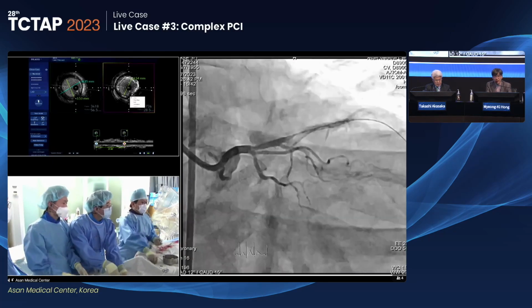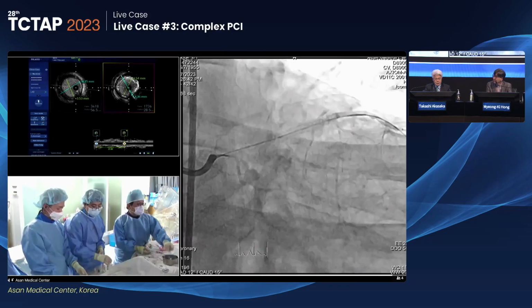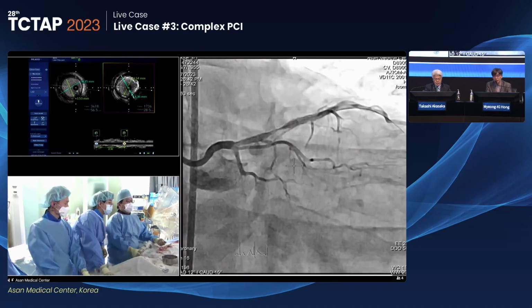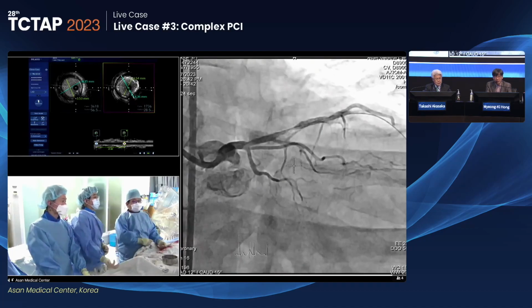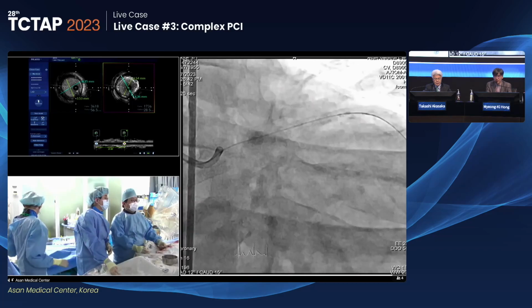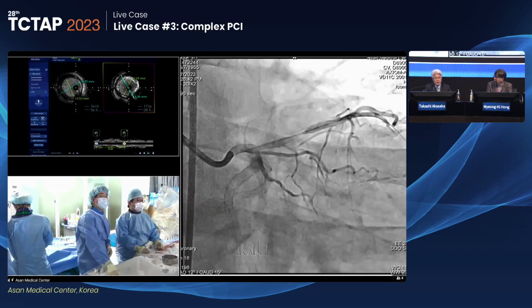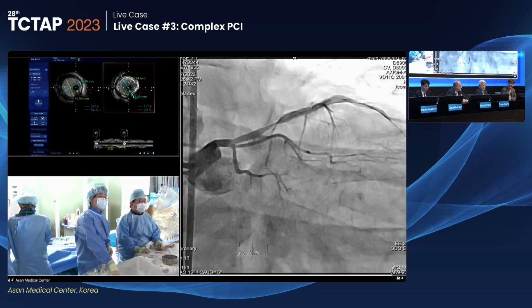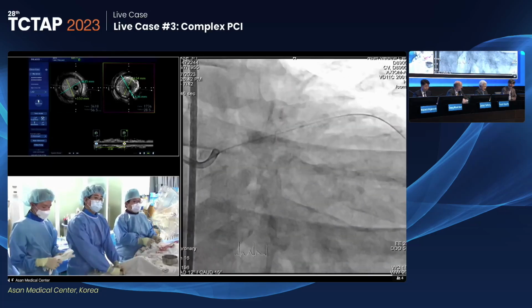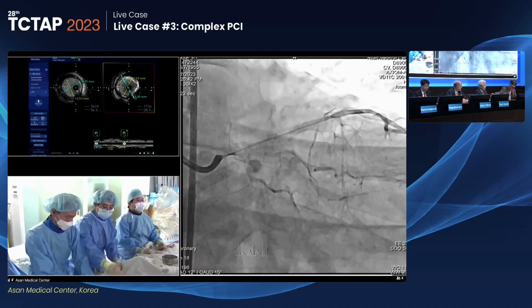And the second one is the angiographic appearance in the LAD ostium. There is some haziness. So we have to deploy the stent from the proximal LAD to the left main. At that time, we lose the chance to do PCI at the circumflex. That is another possibility. Does anybody worry about the durability of more PCI in this biology, given the rapid restenosis and new disease?